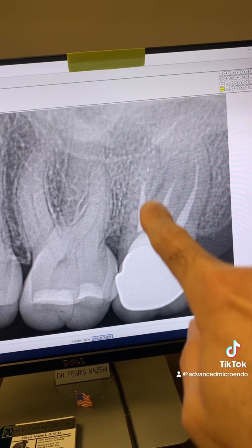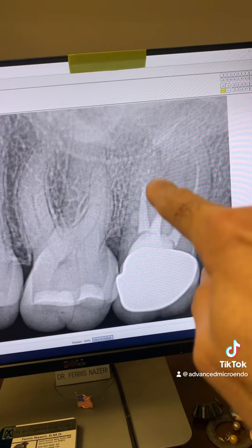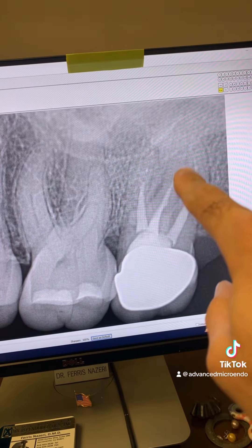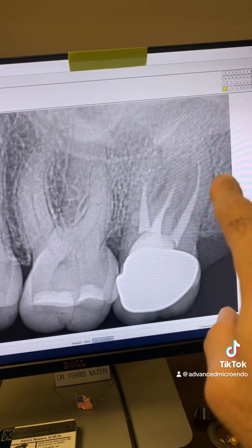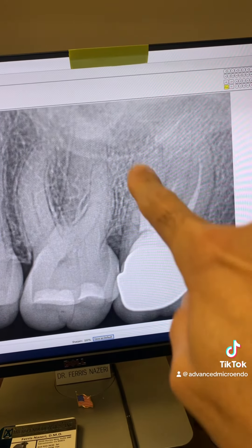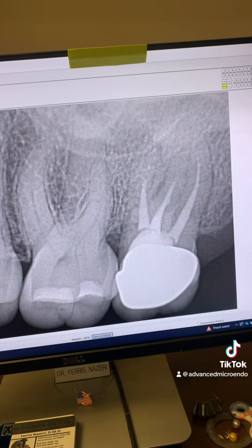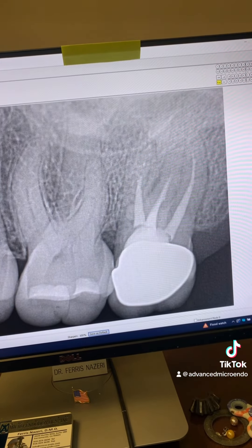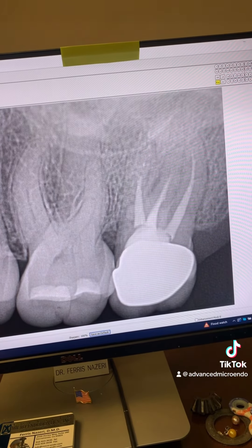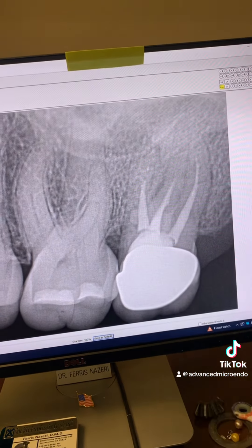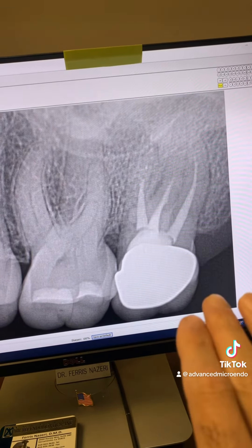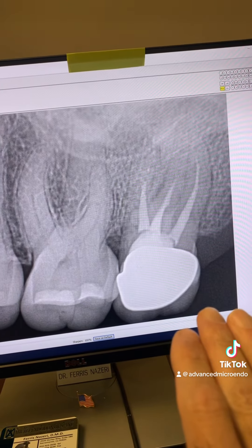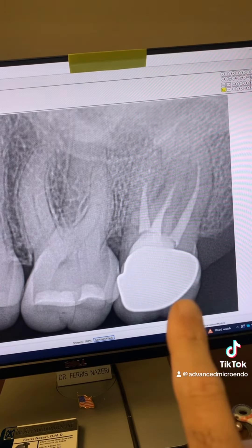Take a look here — crown, buildup, previous root canal. Look how short these fills are. There is no periapical radiolucency. No periapical radiolucency. The tooth was tender to percussion and palpation.